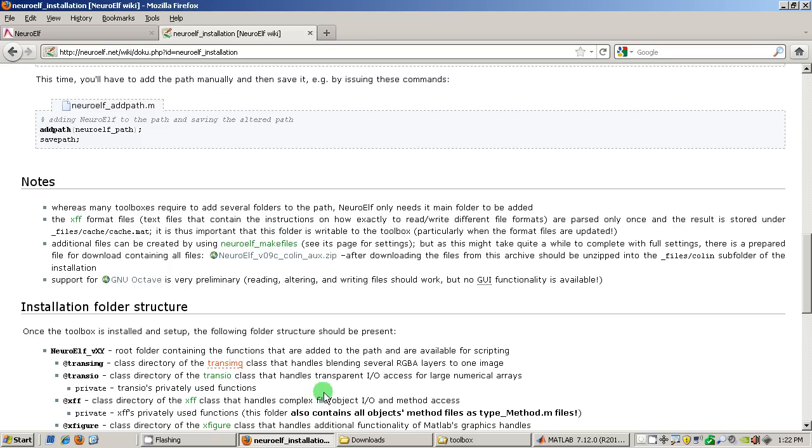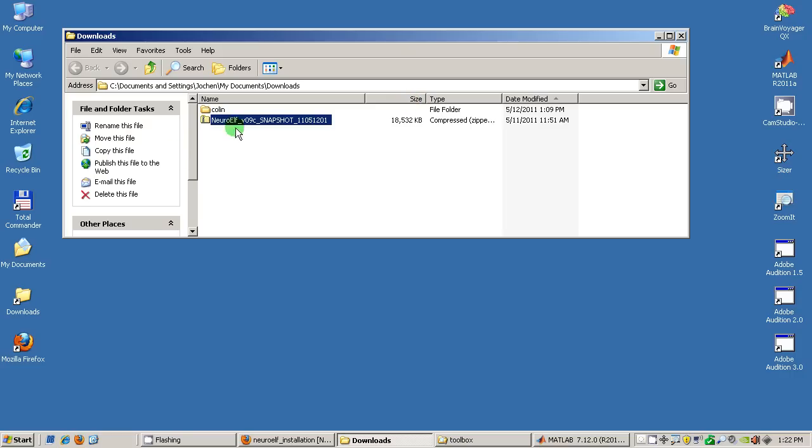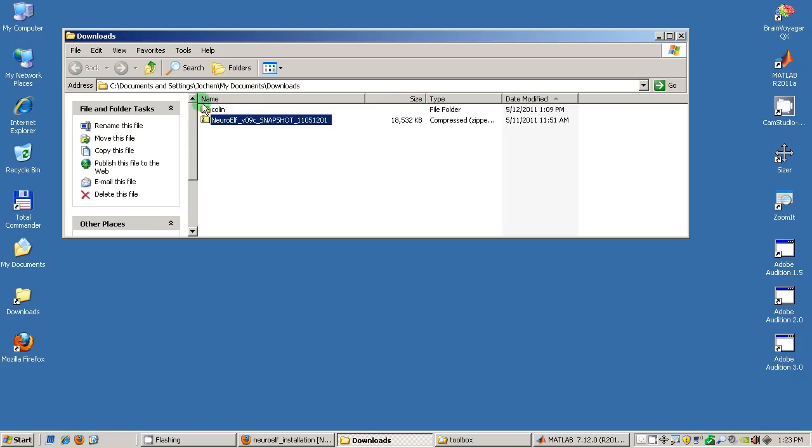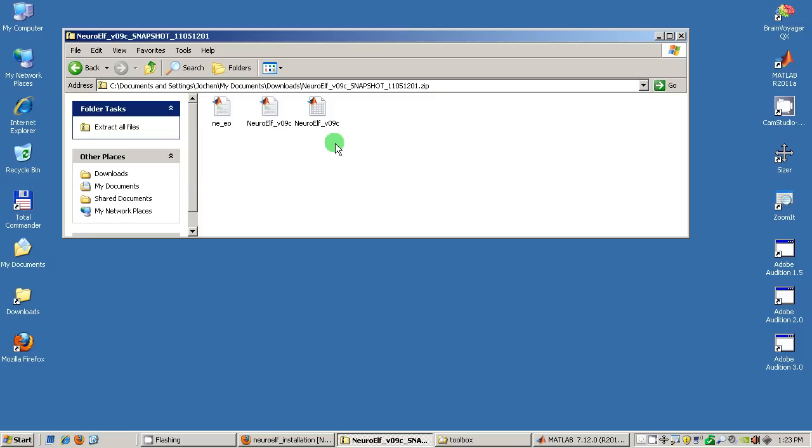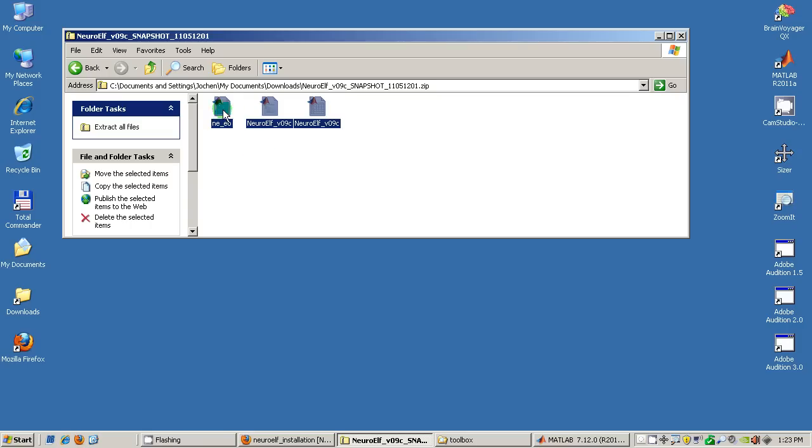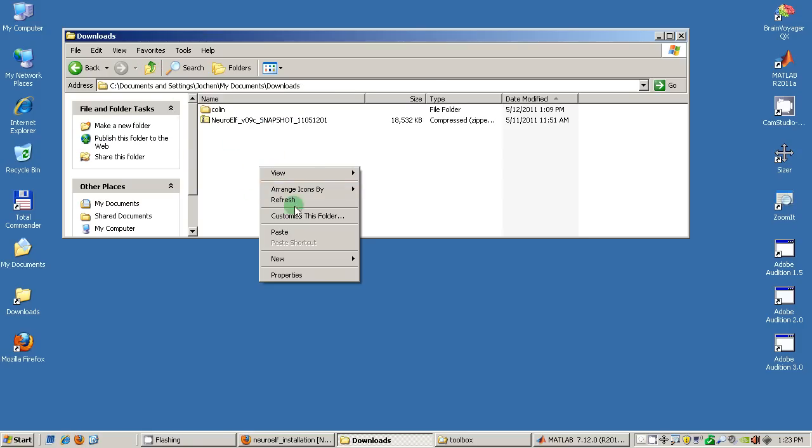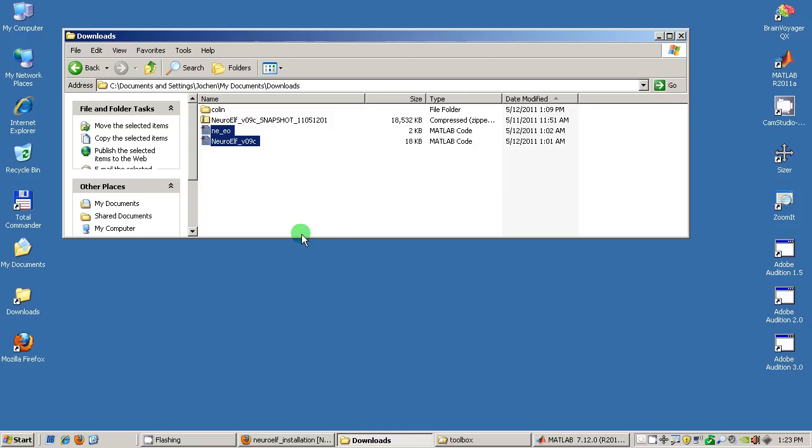So I am now switching to the folder that contains the downloads and as you can see there is the snapshot zip and I already unpacked this zip file with the additional files. I am now double clicking the zip file which does not in fact unpack the files but it simply shows them in a window and so I will copy them, go back to the downloads folder and then paste them so that I can actually use them from within MATLAB.